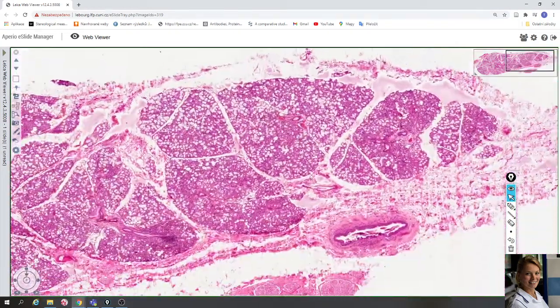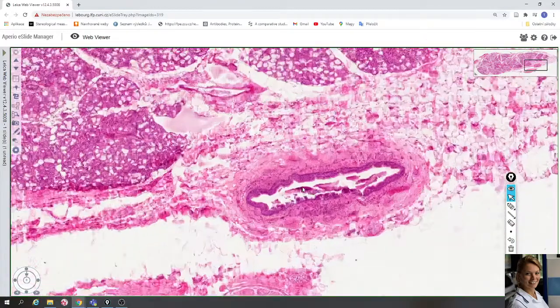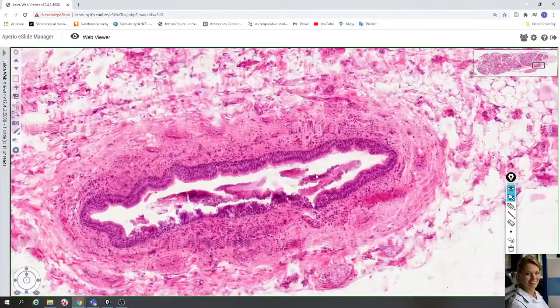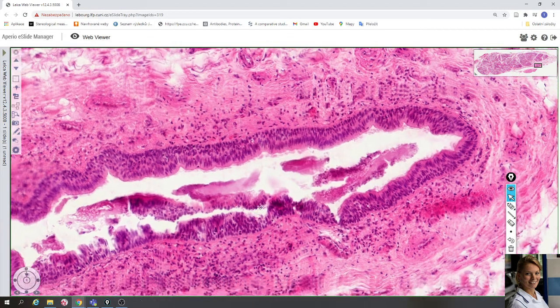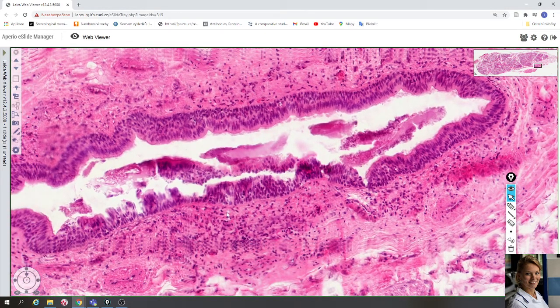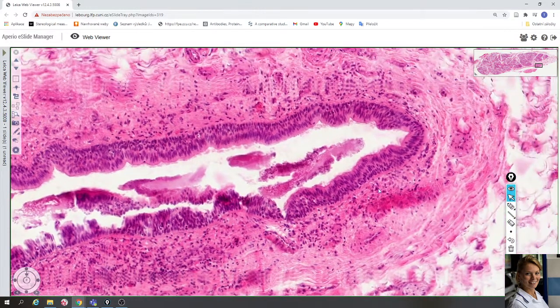Here is a very large main duct lined with pseudostratified columnar epithelium, and in its wall there are a few smooth muscle cells and collagen fibers.